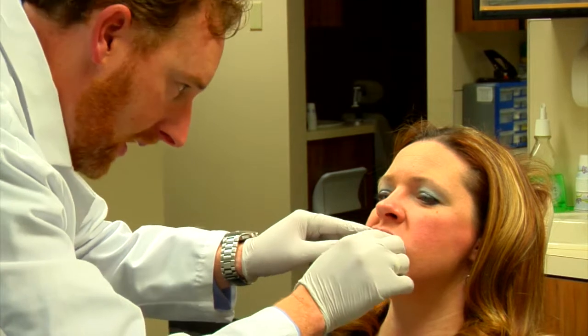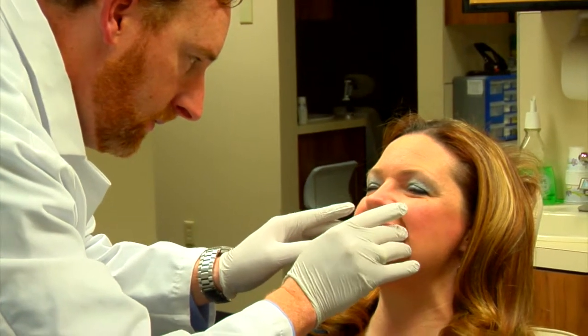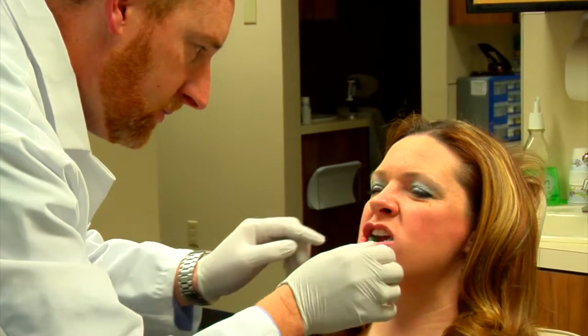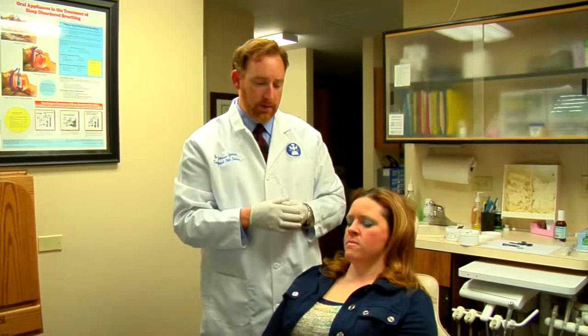Good. And she bit right into that. Her teeth went right into it. Bite down nice and tight. Okay, you don't have to hurt yourself, but just bite nice and tight there. So the advantage of this material is it will bond to itself. As you've seen, I've not used any specific dental instrumentation or devices. This can all be done in really any environment at all. The appliance, after this is now set for another couple minutes here, will be quite retentive on the top.